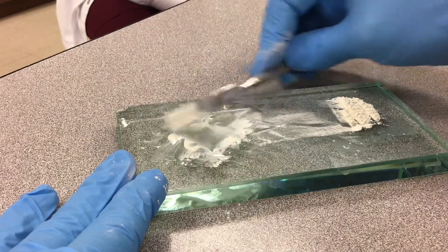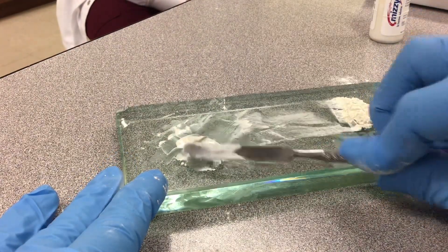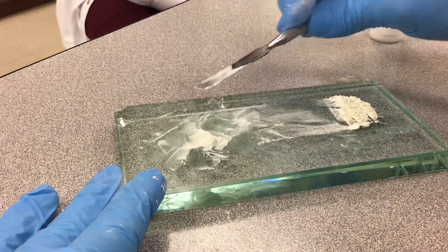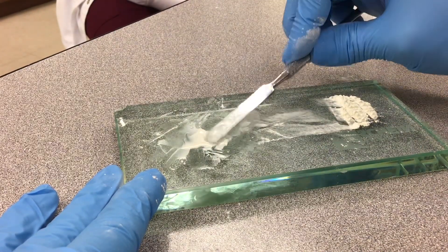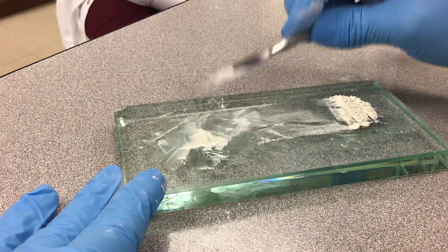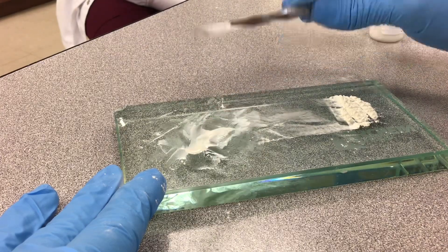Now I think I'm there. I can tell it's a little bit more thick. Put it in a little area — and then the test is, now I know that this is done. So it goes up a little bit. My cement is ready to put in a crown and lay on.